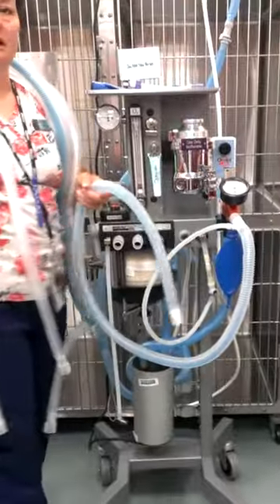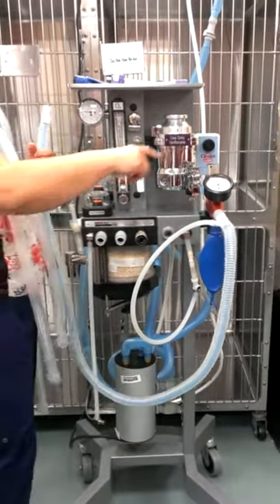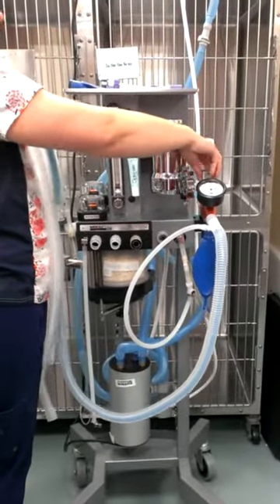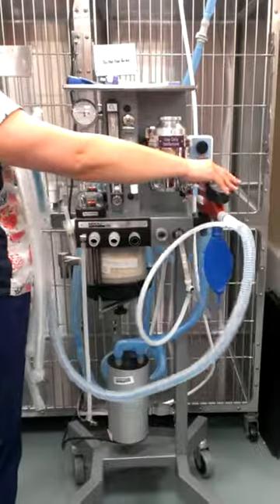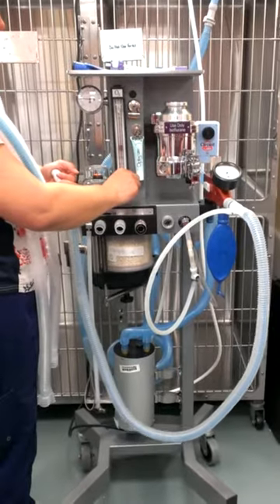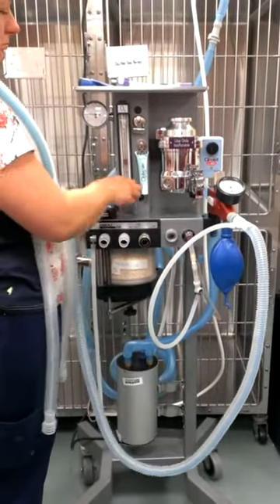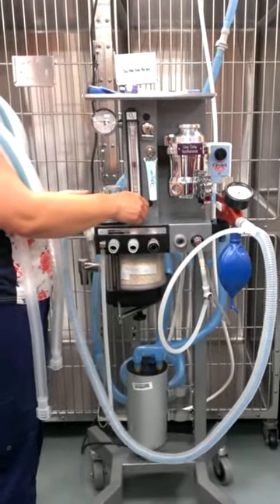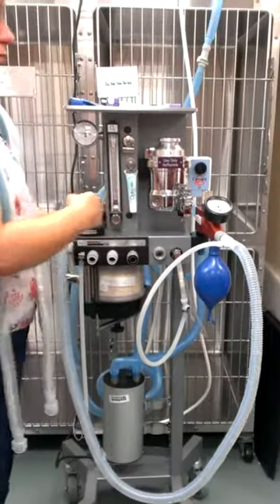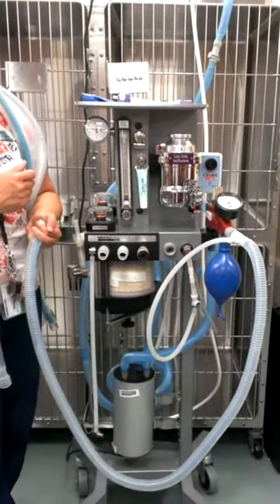To do a leak test, you have to close the pop-off valve. If you've got another body beside you, they can just push it down and hold it. If you're by yourself, you're going to have to screw it down to shut it. Then occlude the end of your tube and turn your oxygen on — it doesn't really matter what you turn it to, you're just letting it fill. We're going to go to 20 cmH2O. We talked about not going over 15 in cats, but when doing a leak test, we want to go at least 20 to ensure proper holding of pressure.